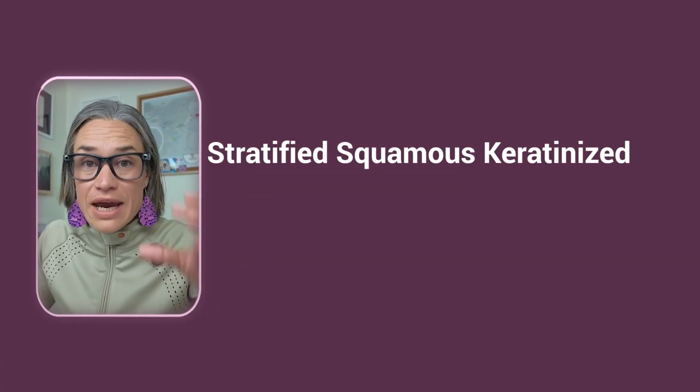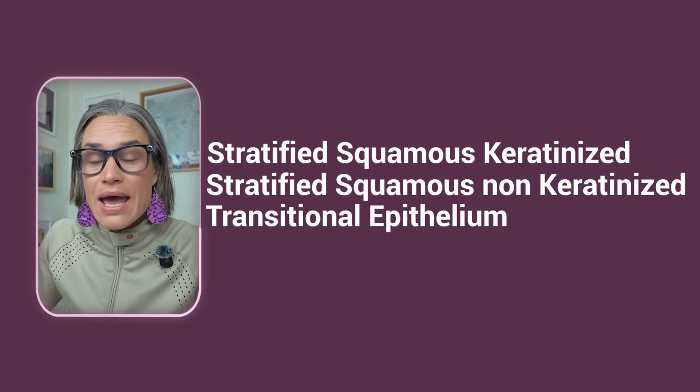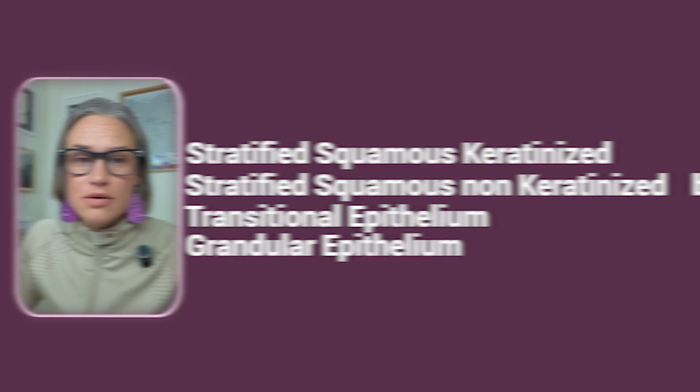Today, we're gonna cover the more complex epithelia. So last time it was simple epithelium, and today we're gonna cover stratified squamous keratinized, stratified squamous non-keratinized, transitional epithelium, and glandular epithelium. And we're gonna start with our slides.